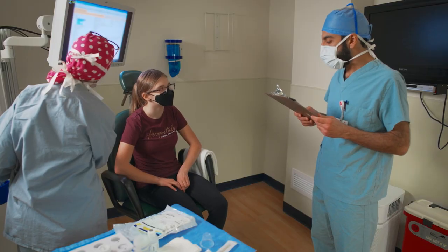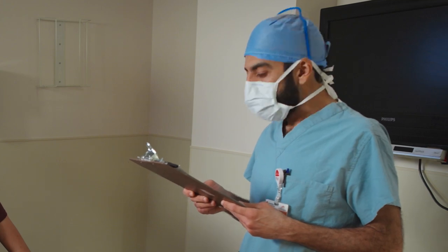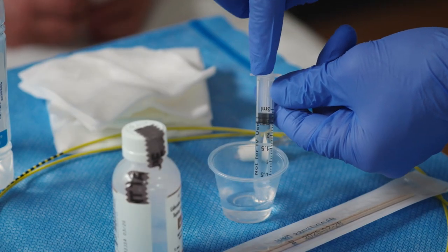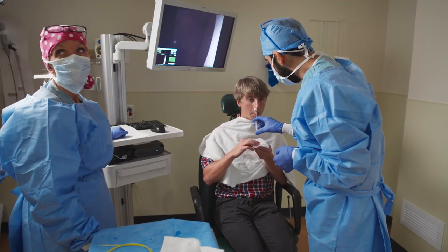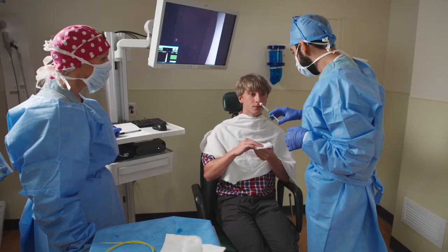Your doctor and clinical team will talk to you before the procedure. First, they will check your information and make sure you're you. Next, your doctor will usually give you medicine to sniff through your nose. Although it doesn't taste great, it will numb the inside of your nose and throat. This can help make the procedure more comfortable.